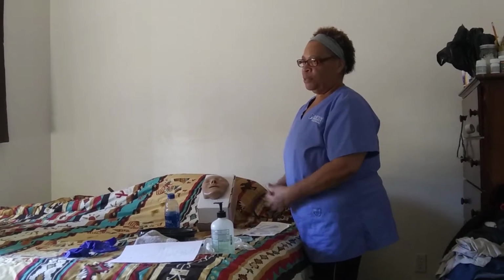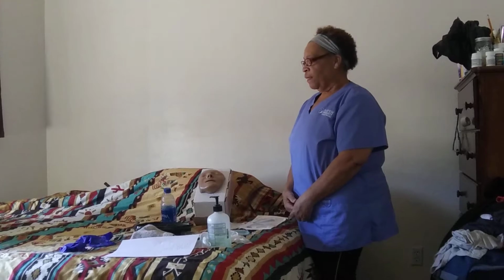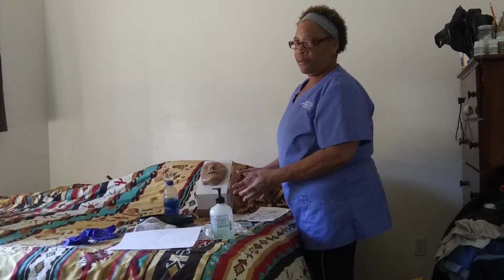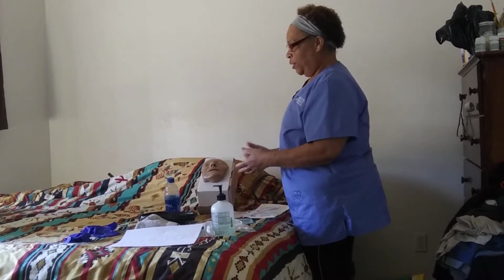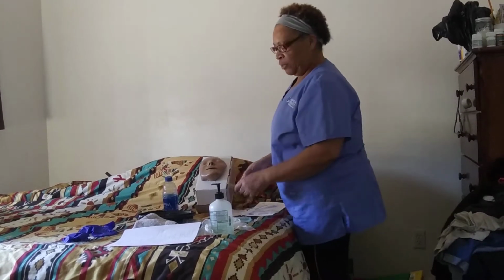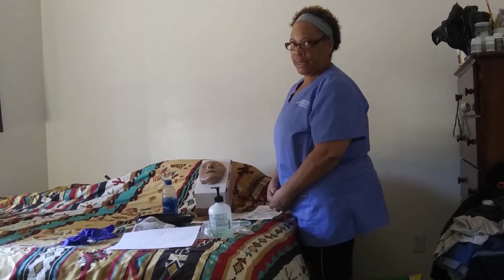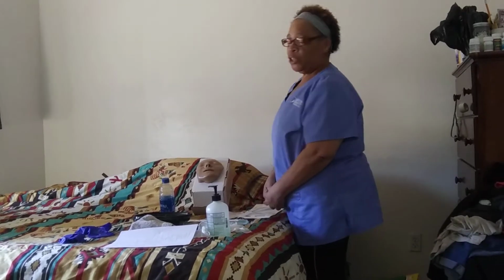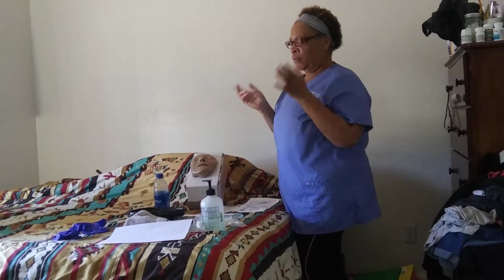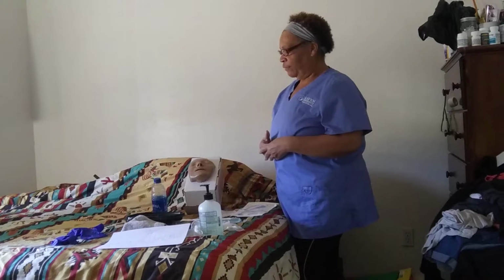Okay, everything's checked. Like I said, I'll be doing vital signs, and I'll place a pulse ox on his finger, make sure everything is okay to go. I then have the patient cough, and check his gag reflex. Okay, so he has good cough skills and he gags. Those are all positive. Then I would check the patency of each naris to make sure it's clear, and that can also determine which nostril I'll be using. So he checks it by blowing, and then the other nostril.